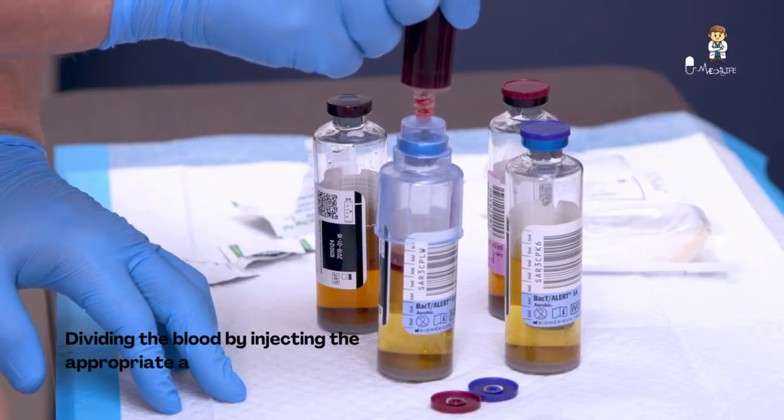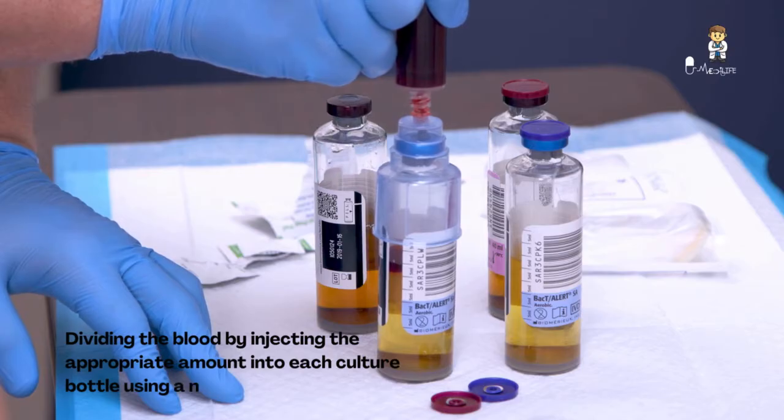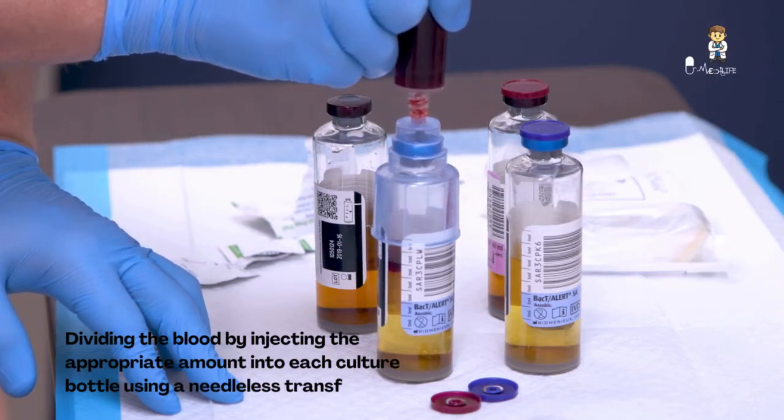Divide the blood by injecting the appropriate amount into each culture bottle using a needleless transfer device to ensure the most accurate culture results.